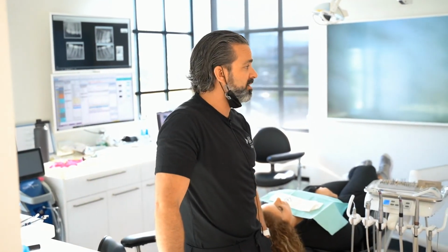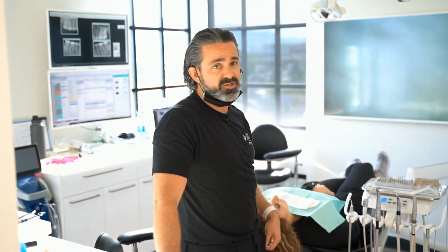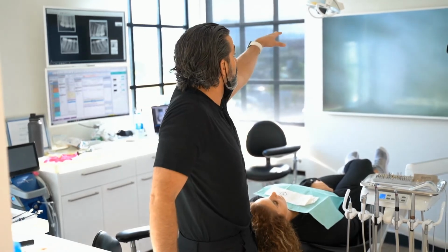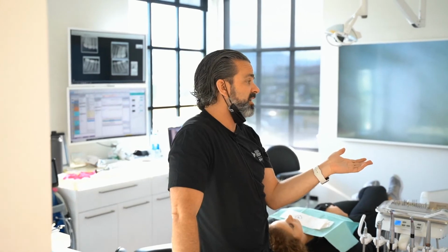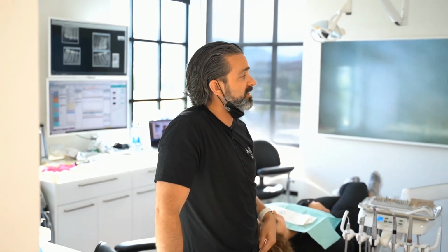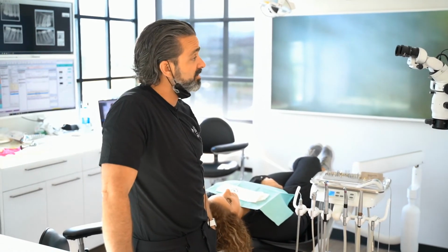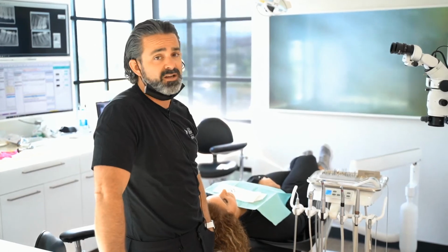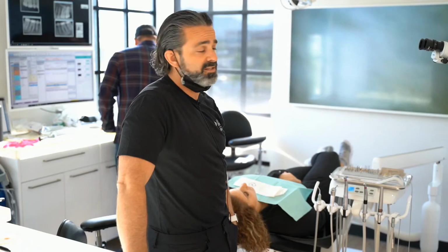The other thing is get dark glasses. You're probably already using them with overhead lights, but like I showed you, the light ring is different on a microscope. The heat difference is on a microscope. Overhead light is really high. And I've been through every generation. I remember the halogen light bulb, then the xenon light was the next greatest craze, and now it's up to LEDs. LEDs are efficient but bright and do generate heat. The xenon really generated heat, so definitely stick with an LED light for sure.